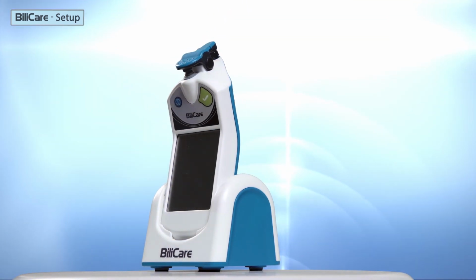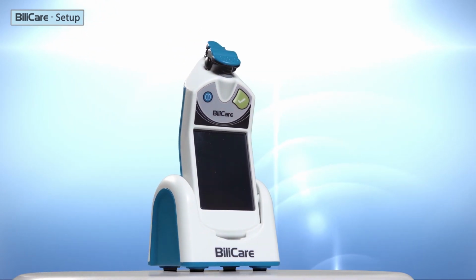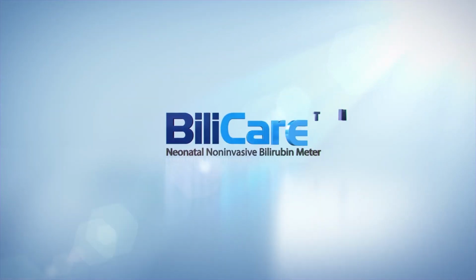Now, after you are familiar with BiliCare's setup menu, you may configure BiliCare according to the hospital policies and your convenience. For further details, please refer to the user manual.